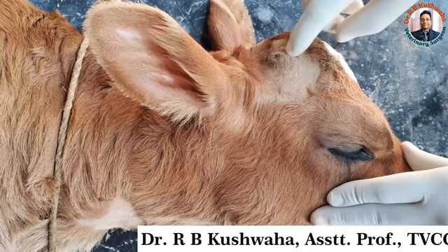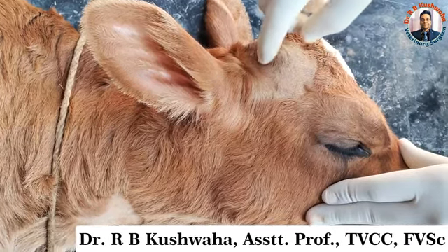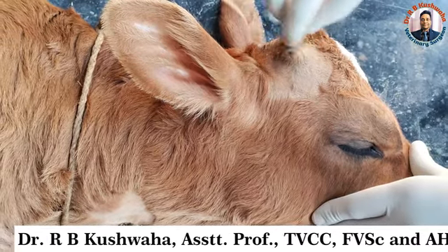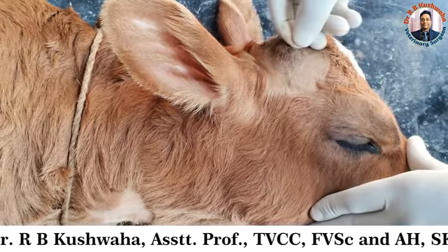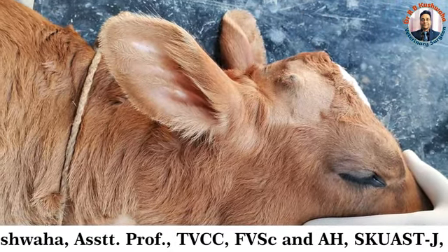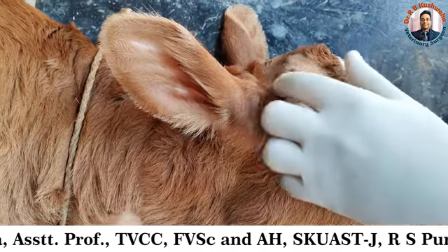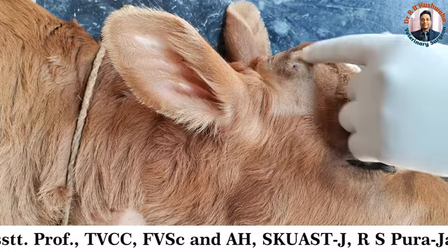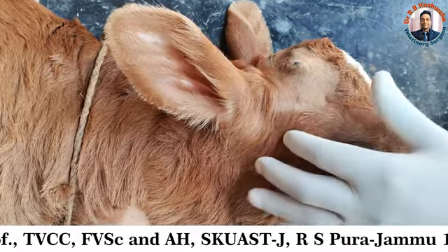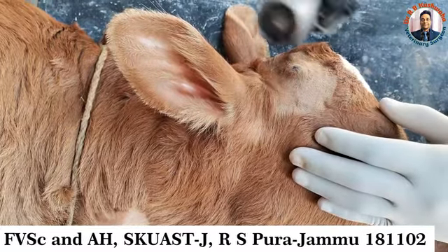The thermal method is very good because we apply a cup-shaped rod around the bud and rotate it, then use a scoop to remove it. I have sedated this patient with a combination of diazepam and ketamine, and also infiltrated a local anesthetic agent around the bud. Although a cornual block is recommended, it is not very effective in young animals.